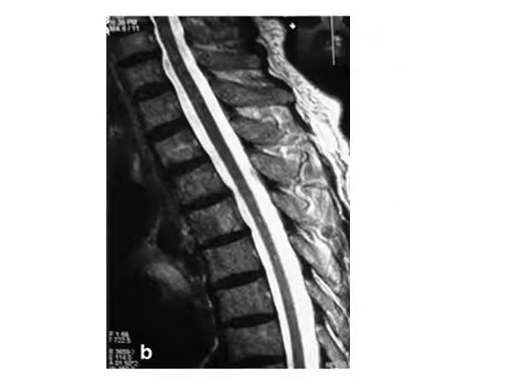Here's the spinal cord that's down here. So you can see that really nice and clear on an MRI. Right, there's the bone again. All right, you can tell it's not a CAT scan because the bone's not bright white. If you're looking at it, it looks like it's outlined by black Sharpie. All right, these are the discs in between the vertebrae.